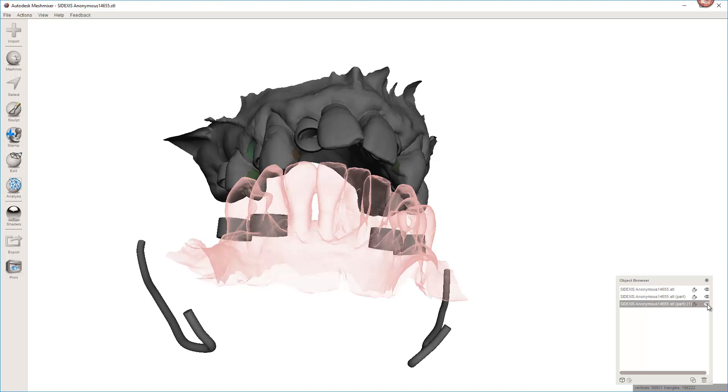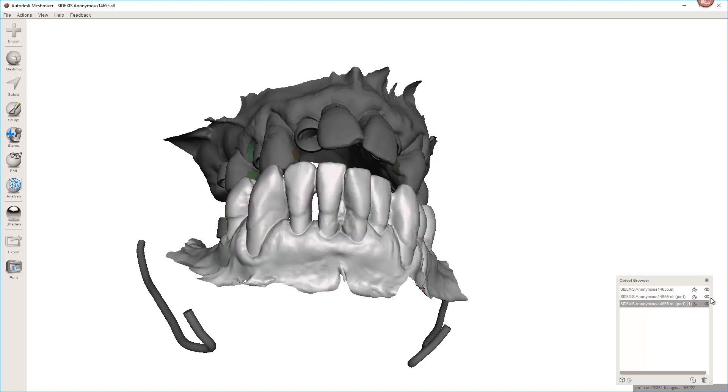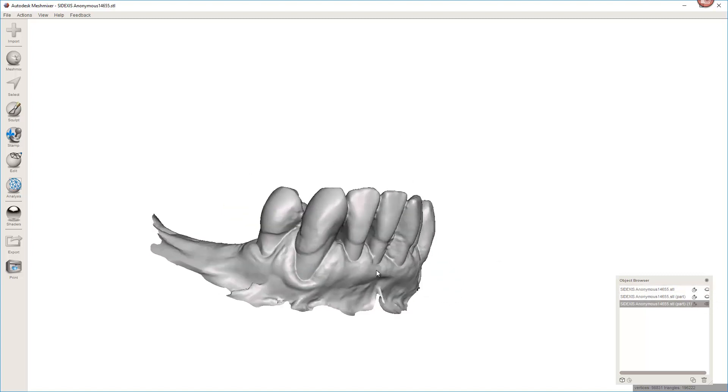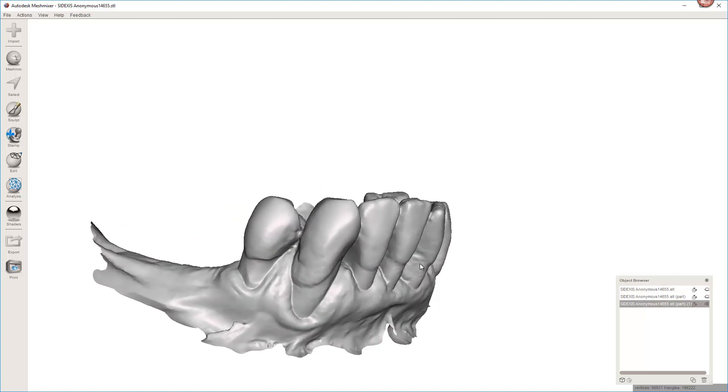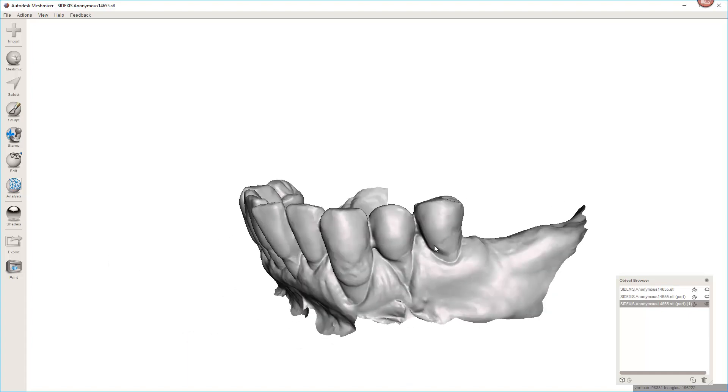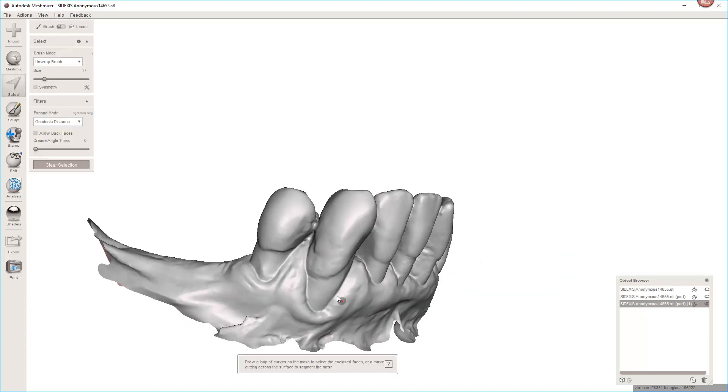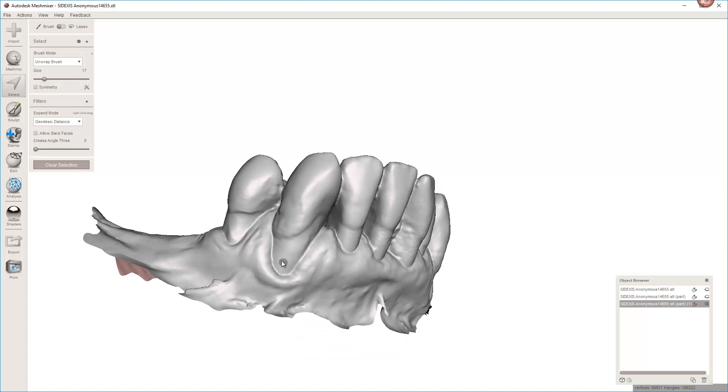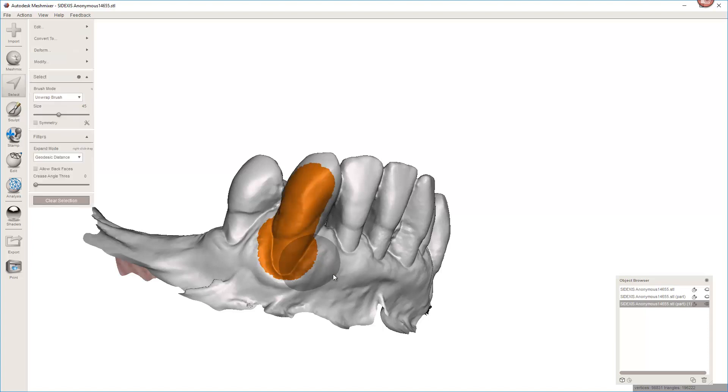So I'm going to go ahead and turn this stuff off. I'm going to focus on getting these canines gone and this second premolar here. I hit S to select and I'm going to mess with the brush size. The problem is if you have it too big, you get a lot of bleed over and you have to come back, hold shift and deselect and it just gets tedious.